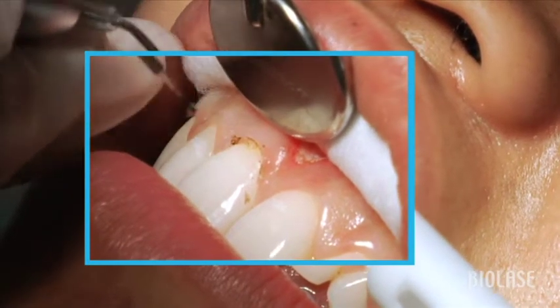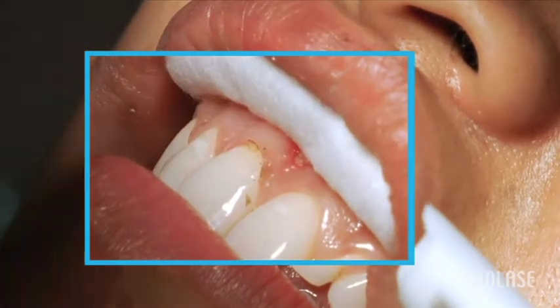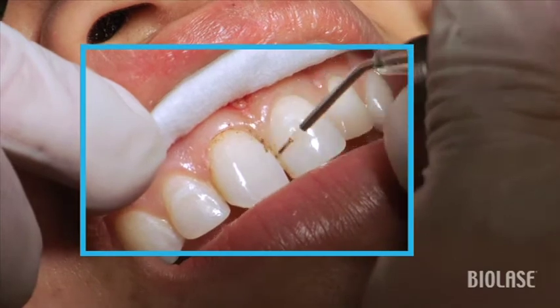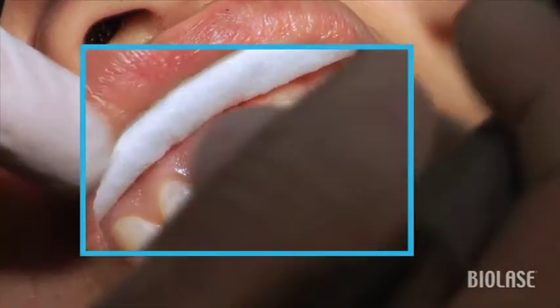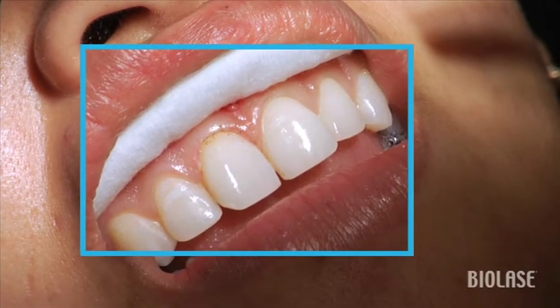At this point, you've probably noticed that this is the same patient that we recently completed the labial frenectomy procedure on. I believe that this emphasizes the multifunctional uses of the iLase, where we're able to do multiple procedures in one appointment, and most of these procedures we were not able to offer previously.